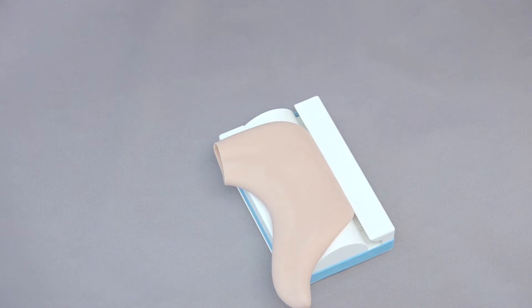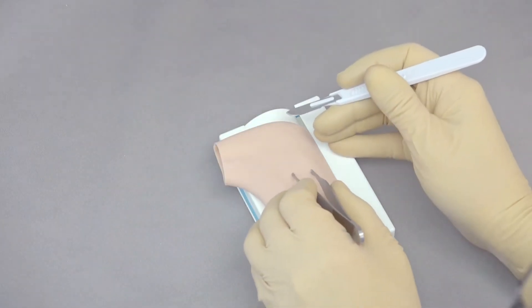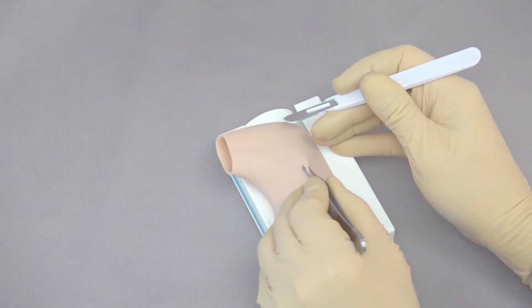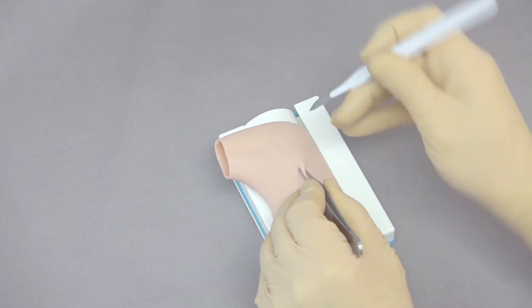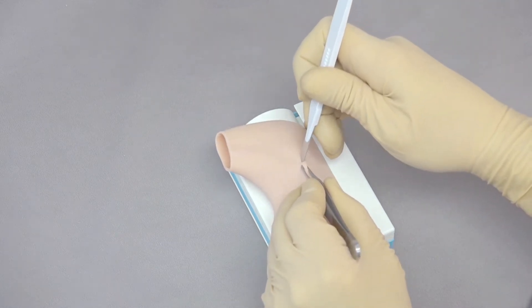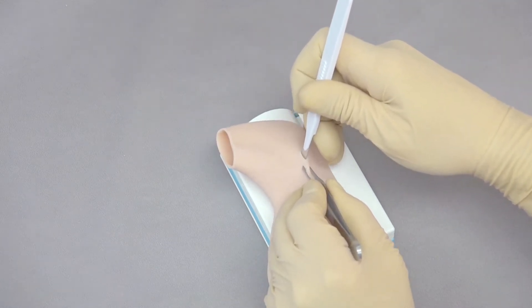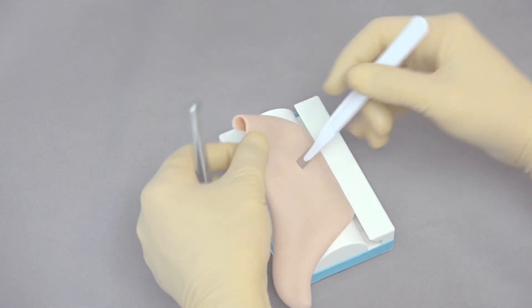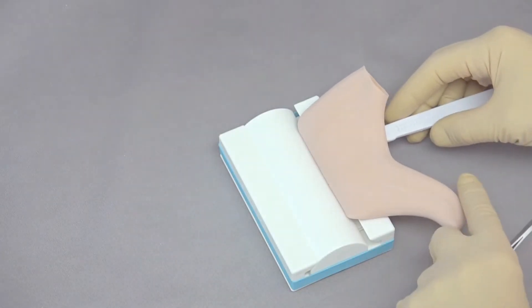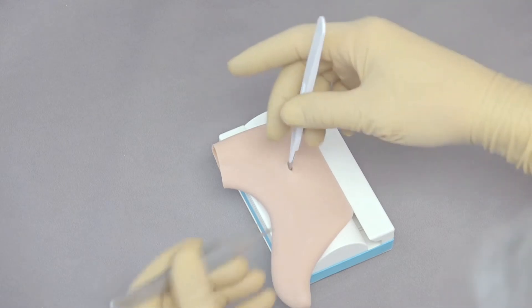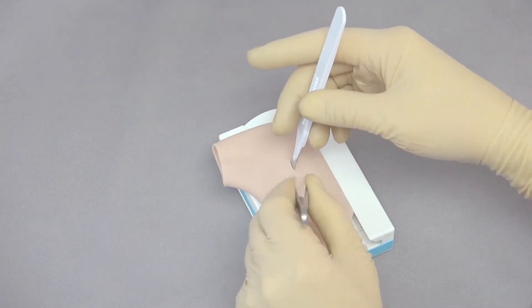First we need to make an incision, and it's important when making an incision in the stomach to tension the stomach, to tent it up to make the incision because otherwise you cut through both sides. In this case we pull up and push straight down into the stomach, and you can appreciate the beauty of the stomach because we didn't go through to the other side. We just got to the one side, so we tensioned that.